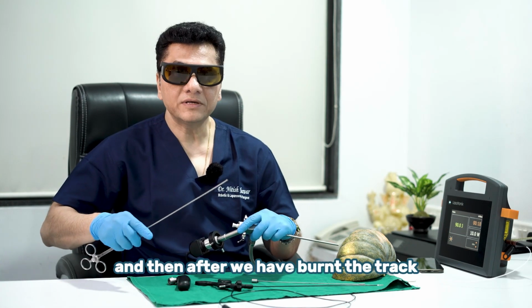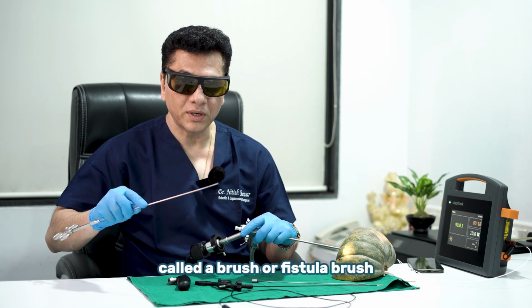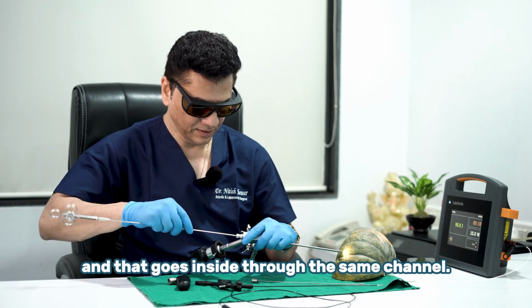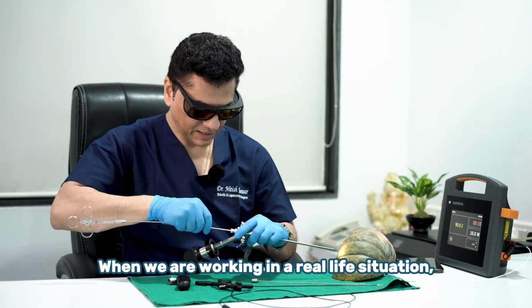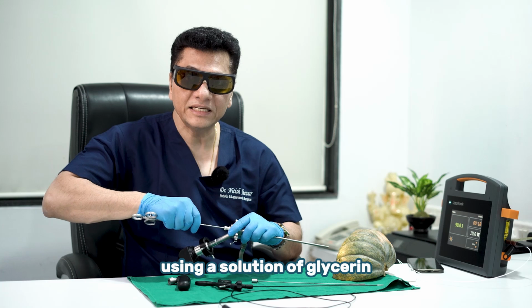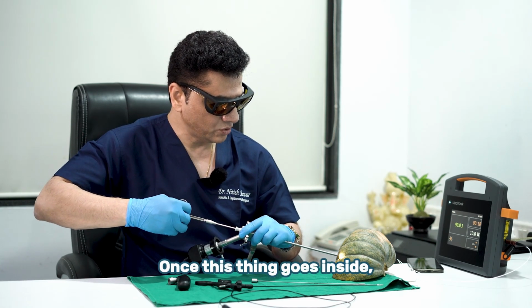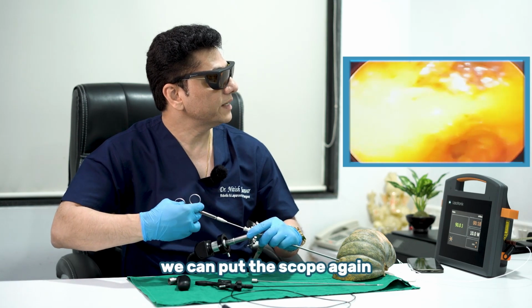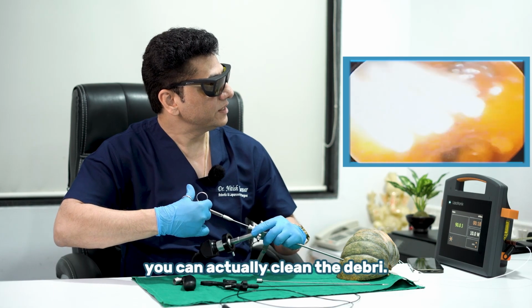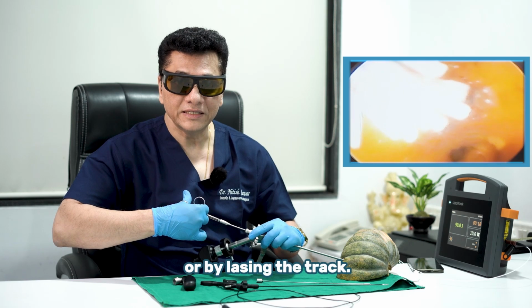After we have burnt the tract using a laser fiber, what we are going to do, we'll put in a retractable device called a brush or fistula brush, and that goes inside through the same channel. When we are working in a real life situation, that time we are washing the tract using a solution of glycine or with normal saline. And once this thing goes inside, we can put the scope again, and as the brush advances inside, you can actually clean the debris which you have created by using laser or by lasing the tract.